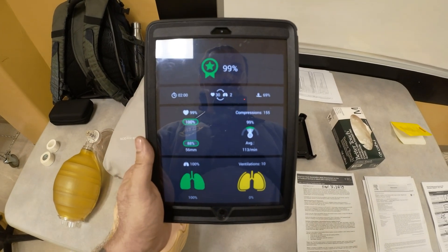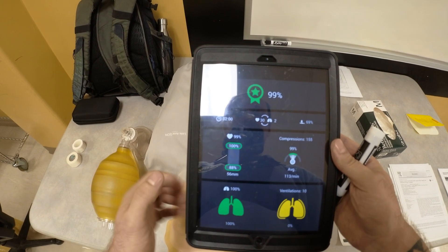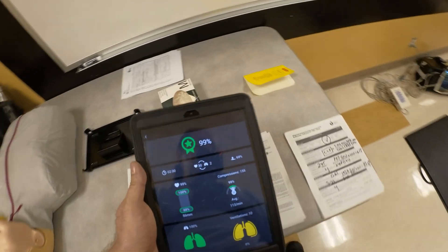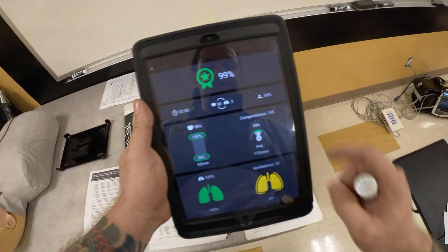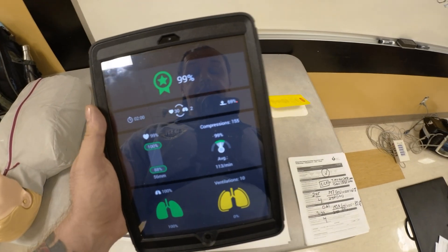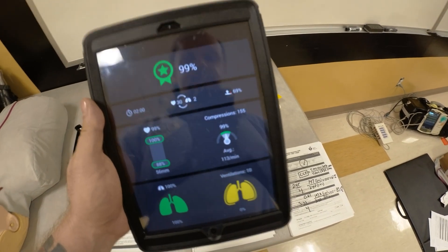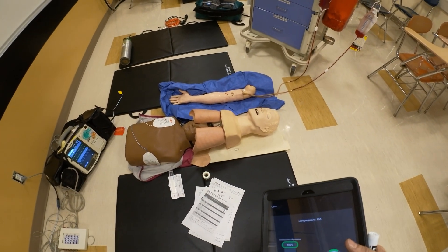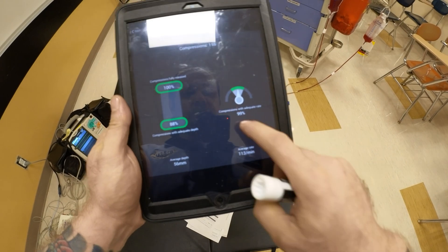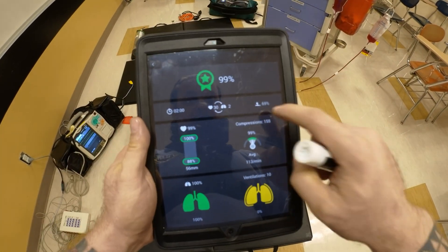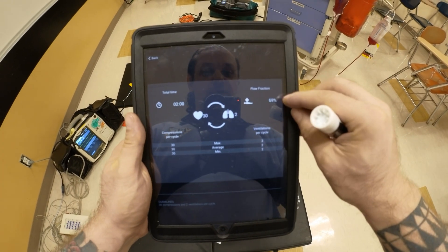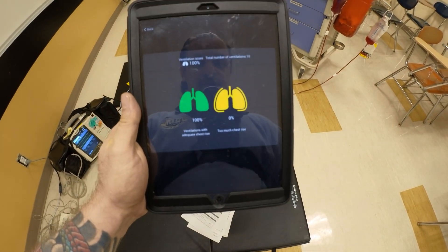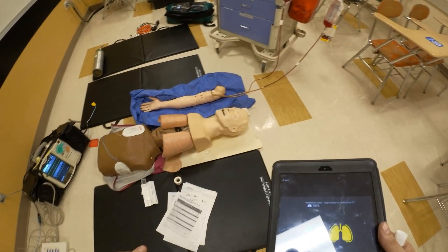The data that you can get from this app after you finish your scenario: you can essentially get your chest compression fraction. So if you're running your megacode station, you're able to get the CCF. Be cognizant that if you are doing this for ACLS and employing this setup with a test trainer to deliver ventilations, you're not going to get any registering ventilations — you will not be able to see that. So the flow fraction was 69%, chest compression fraction, and our ventilations all went in — but you will not be able to see that if you're using this test trainer.